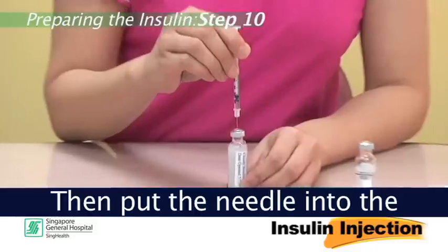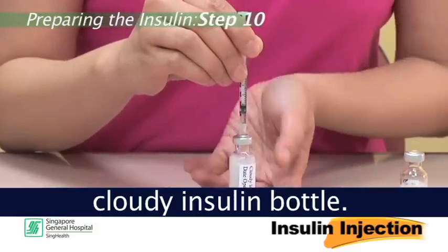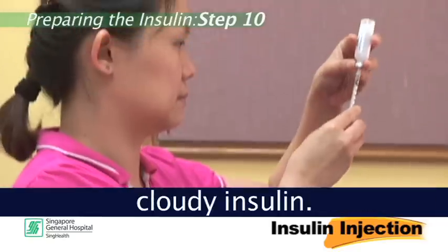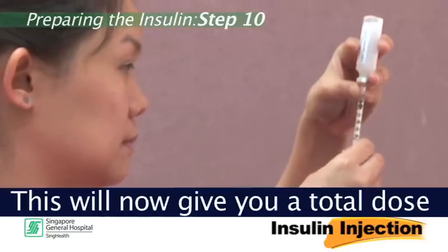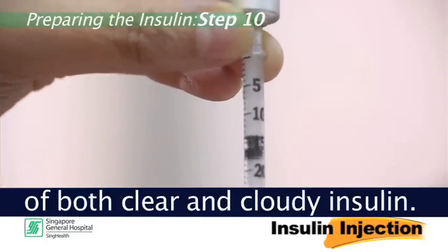Step 10: Then, put the needle into the cloudy insulin bottle. Invert the bottle and withdraw the cloudy insulin. This will now give you a total dose of both clear and cloudy insulin.